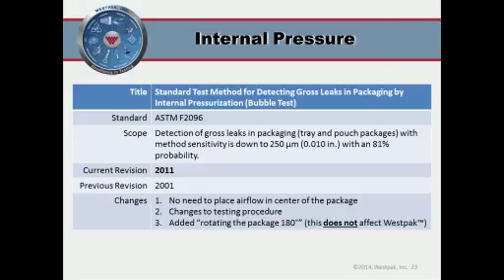Thanks, Katie. It's being done underwater. Can you imagine that? The testing of a porous membrane, with a porous membrane test, if you will, this pressurization underwater, it's kind of like blowing up a balloon with a bunch of holes already in it.